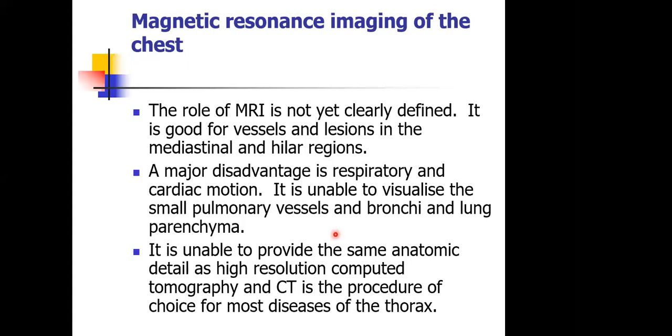So when we employ it to evaluate any pathology in the chest, we are only using it to answer some specific questions. For example, we know it is good for blood vessels and lesions within the mediastinum, and basically to answer some specific questions related to that area.